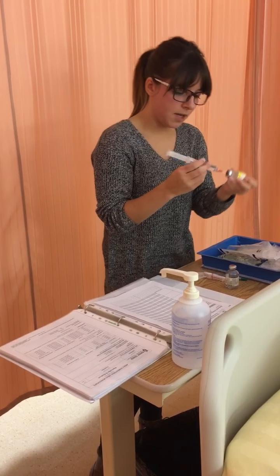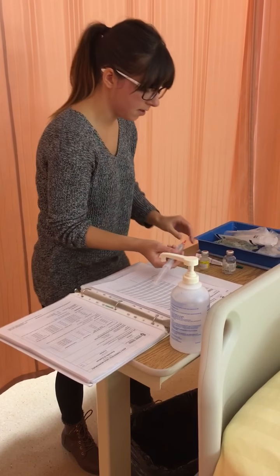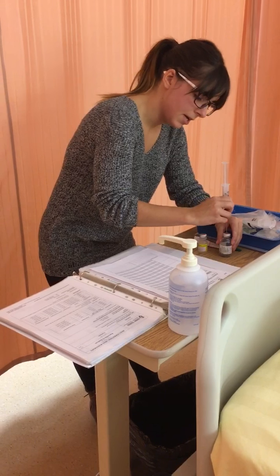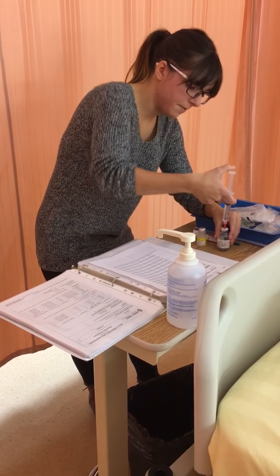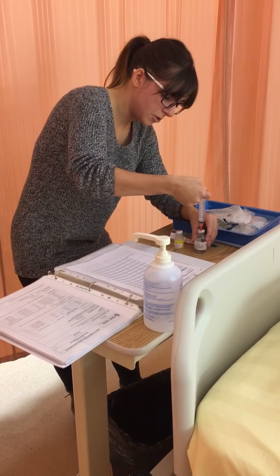Okay, so we have 8.2 and there are no air bubbles. That's good. Then I'm going to insert the normal saline into the penicillin vial. This is when we're reconstituting the drug here.